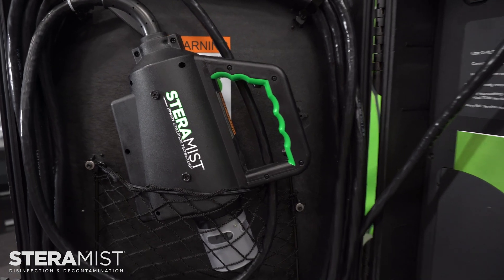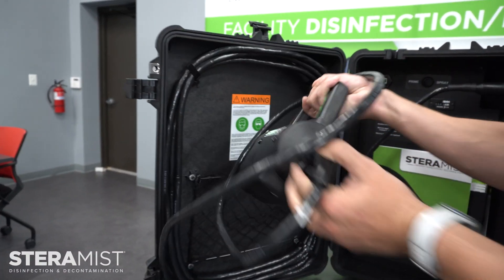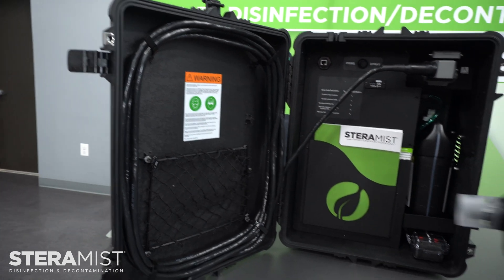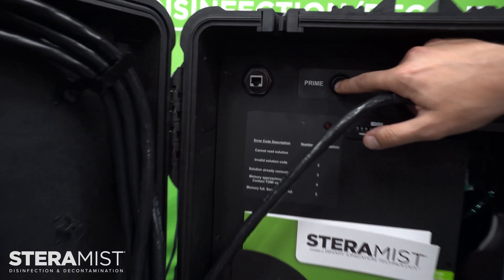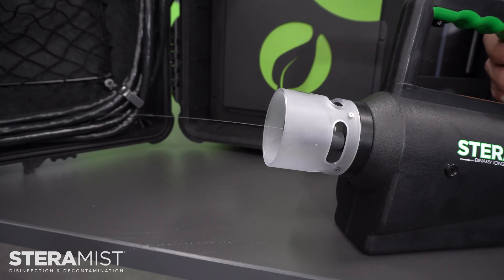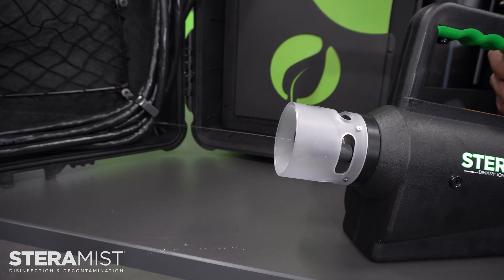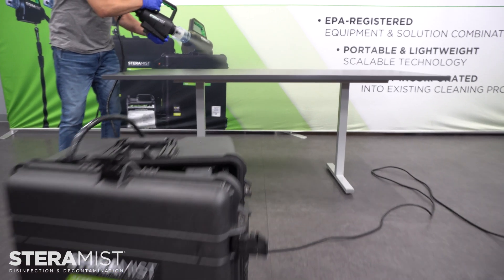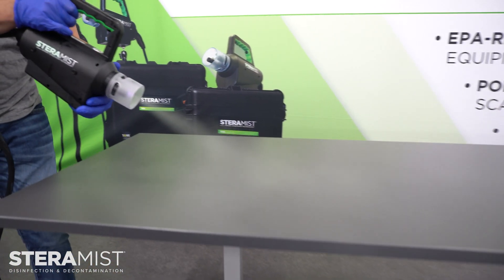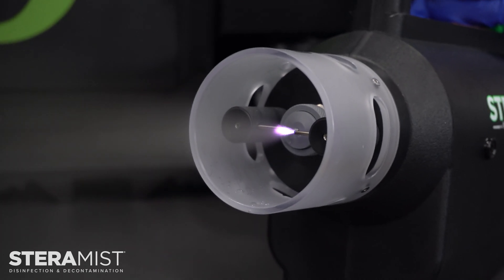Take the applicator out of the convenient storage pocket. Then switch to prime to allow all of the air to be released from the hose. You are now ready to use your all-in-one disinfection system. Just switch to spray and you are ready to point and shoot to eradicate bacteria, viruses, and mold spores on any surface with IHP technology.